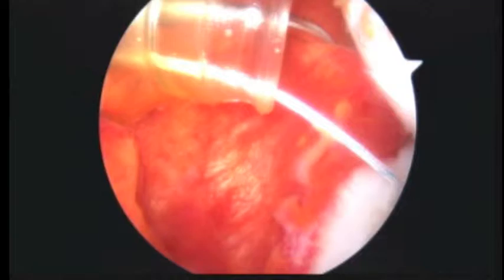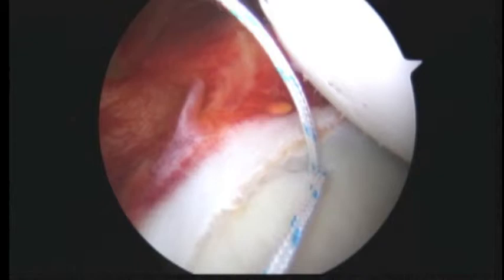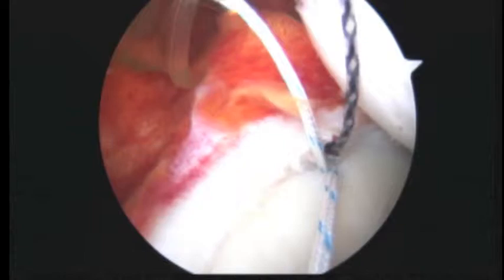You can see how we go through there, and now the next step is to go down. You can see how we are really going right through that labrum as well. You can see why I wanted to use the anchor, because that labrum is not completely intact there — it's torn on the edge.